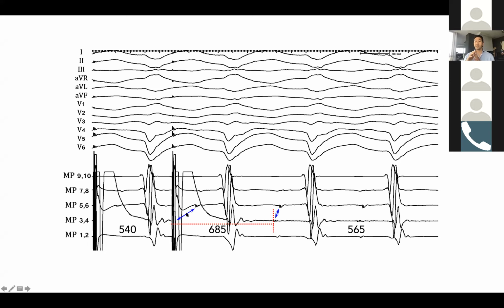So this, you probably haven't seen before, is a multi-electrode demonstration of one electrode being a bystander and the other one being the isthmus, and being able to record both activities at the same time. That's what's special about this tracing. How does that look if you can't conceptualize that graphically?